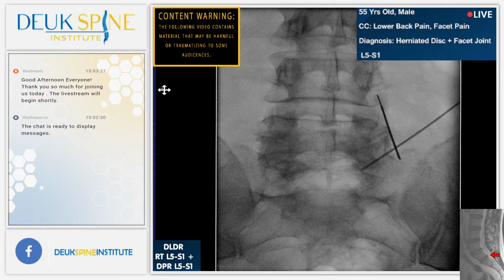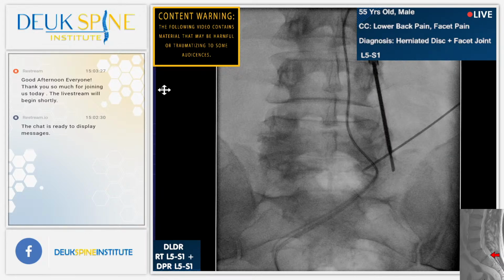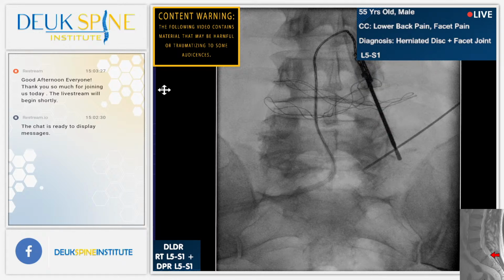Yeah. We're just lateral to the facet at 5-1. Go ahead. Is he all right? Still sleepy? Very sensitive. Well, I don't think he takes much in the way of medications. Yeah. So it's not surprising. He's very sensitive. All right. That's nice.